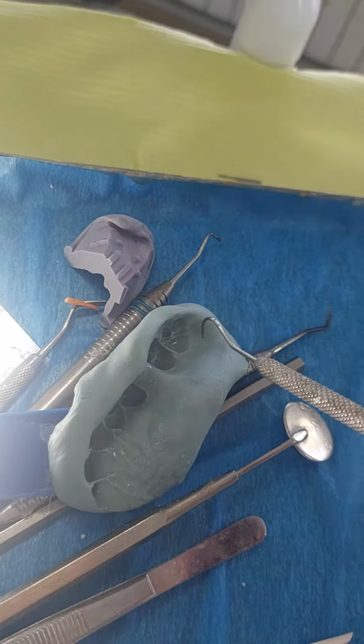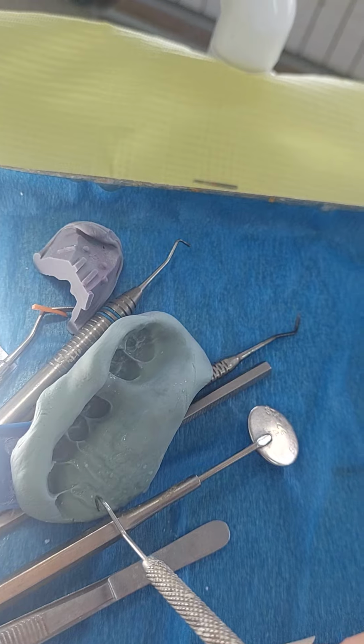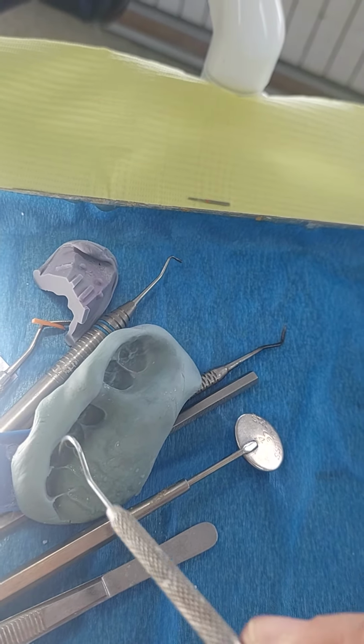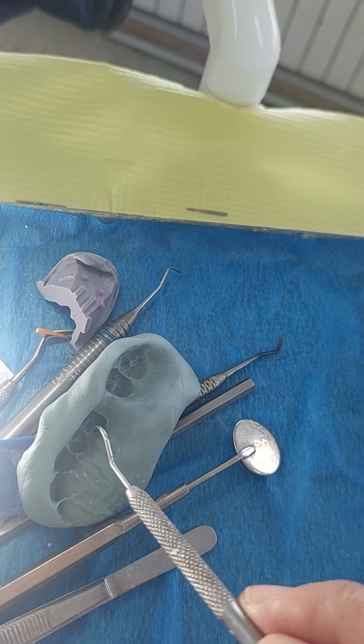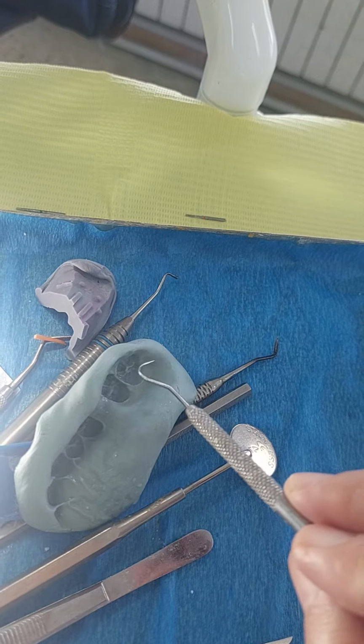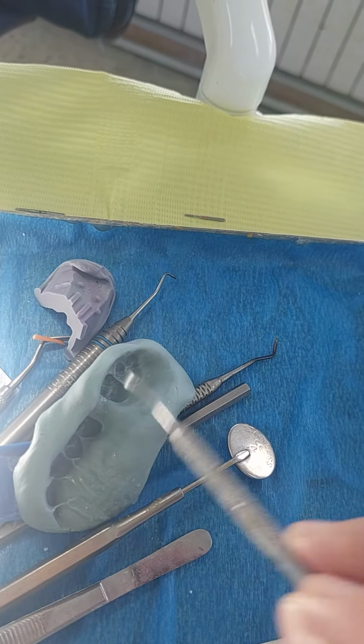You can reduce everything around here, reduce it with the blade, even reduce some extra teeth away from the abutment. So this is an abutment. I leave one tooth intact and remove the excess. Remove the excess on the buccal. Remove the excess from distally. What will happen? This will be seating easier.